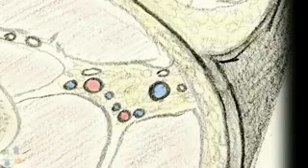There are multiple possible places to start an ultrasound-guided IV, but a good place to begin looking is in the antecubital fossa. An alternative would be the proximal anterior arm along the course of the cephalic and basilic veins. The basilic vein runs with the ulnar and median nerve, so care should be taken not to injure these structures with cannulation. The deep brachial vein runs its course down the middle of the anterior arm and is another site for cannulation. Caution is advised when attempting to cannulate the deep brachial vein, as it runs with the deep brachial artery, and care must be taken to ensure you do not cannulate the artery.